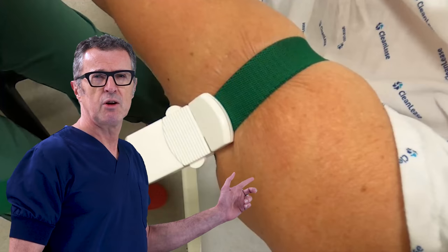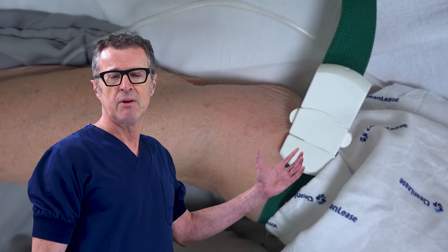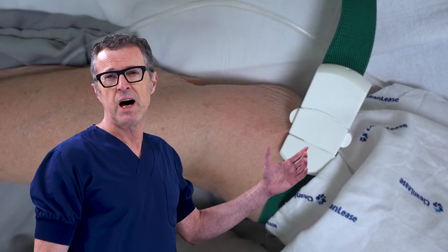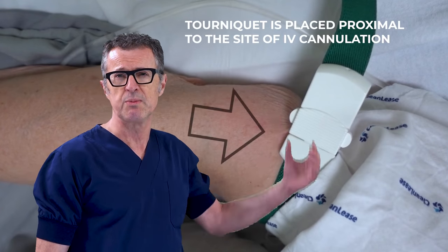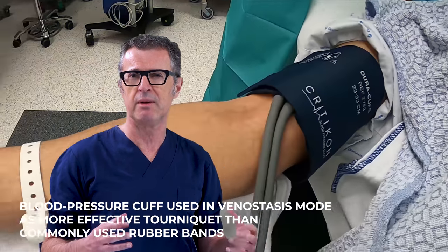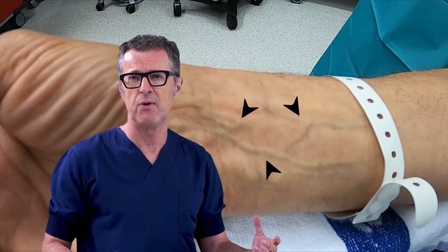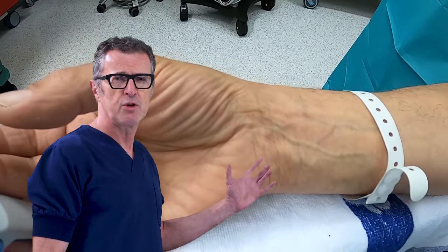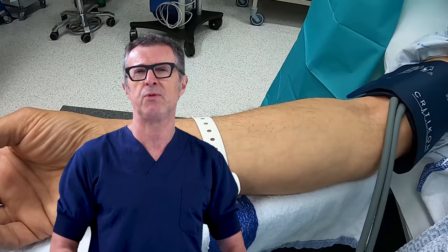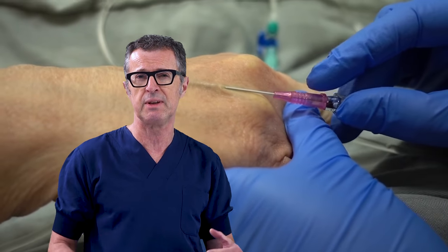Tourniquet is almost always used to engorge the veins during IV cannulation. It is placed around the limb at least five centimeters or more proximal to the site of intended cannulation, and placed tight enough to engorge the veins with blood, but not as tight as to abolish the arterial blood flow into the extremity. This engorgement makes it easier for the operator to locate veins and successfully thread the catheter inside.